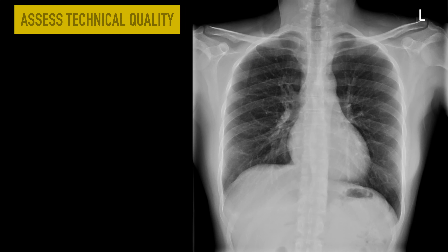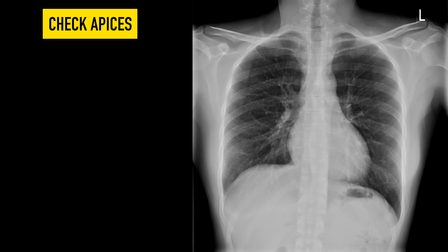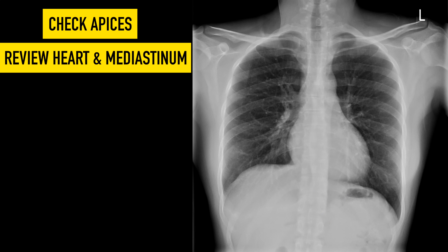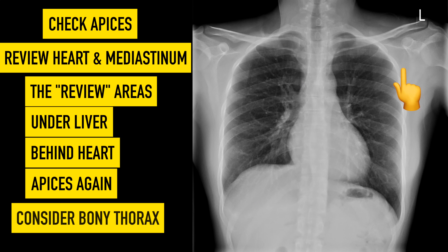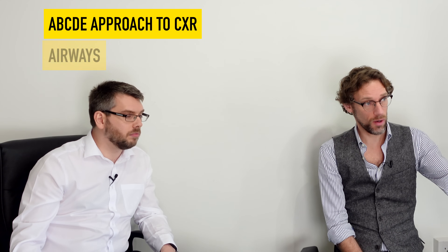I always like to start at the very top, work my way down, back around, and back up again. Once I've assessed sufficient technical quality, I look at the apices of one lung, move all the way down, start at the apices of the other side, move down that lung, then look at the heart and mediastinum, then go back and look at the review areas — underneath the liver, behind the heart, back at the apices again — then consider the bony thorax. The important thing is to do everything systematically, take in everything, and not stop searching once you've seen something, because some patients have more than one pathology.